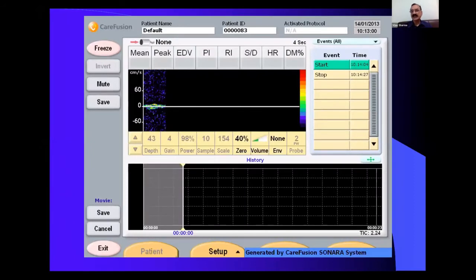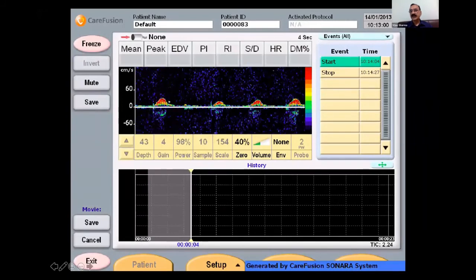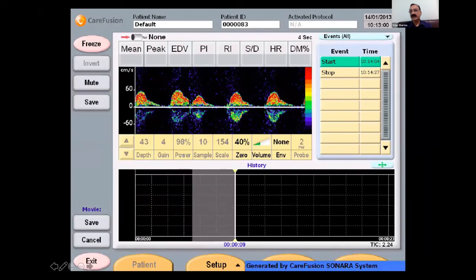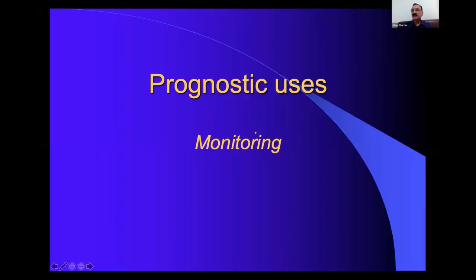But if you're putting on TCD, don't think you are doing a therapeutic TCD. Just think what you're doing is you are monitoring what is happening to the artery. You may be the wonderful person to see how the artery recanalizes once your TPA is working. From minimal flow in the MCA, you start seeing in real time how the blood flow is moving as the clot is dissolving. As the clot dissolves, what you see is your patient's hands are moving up.